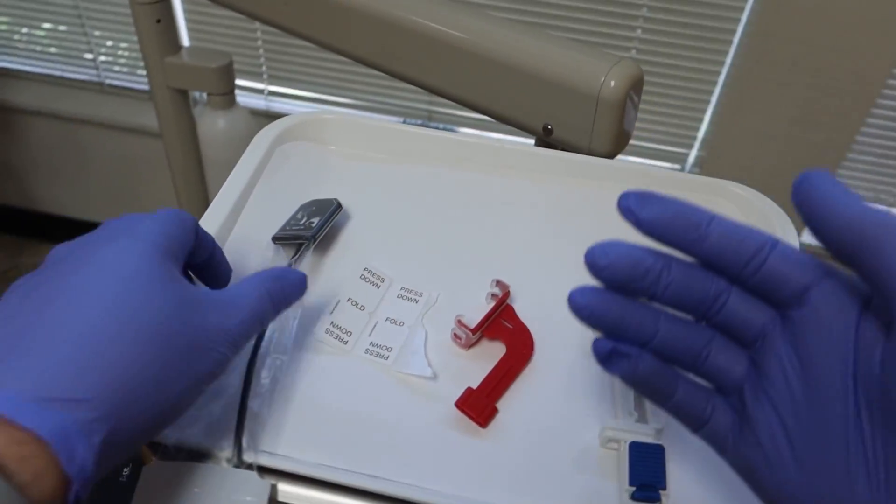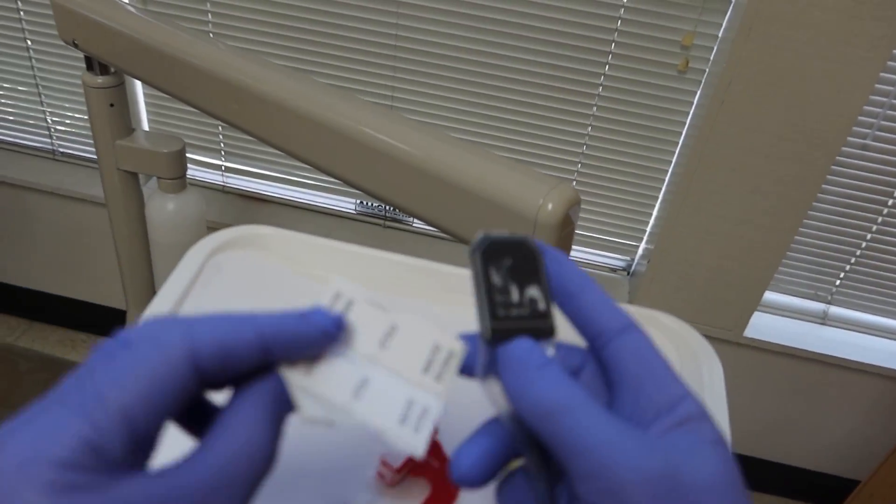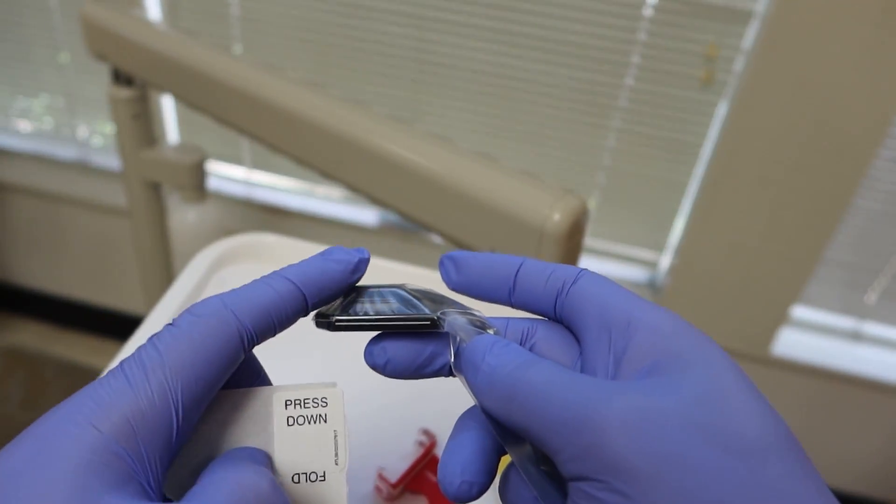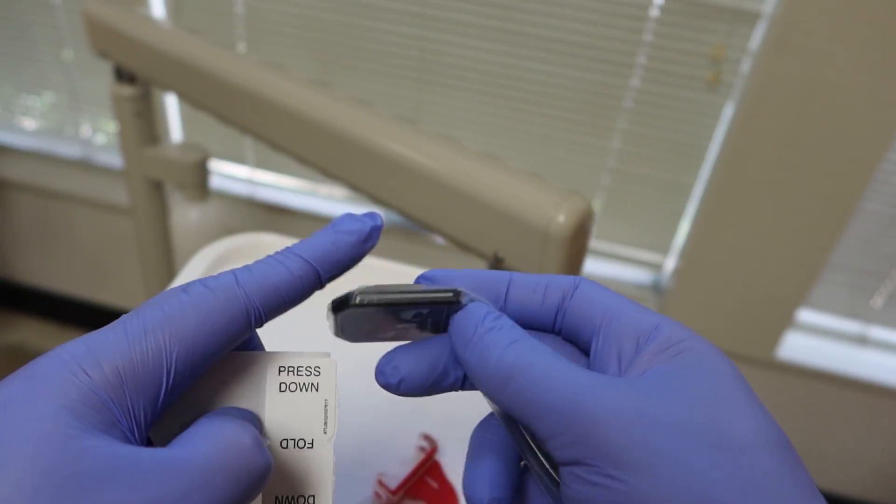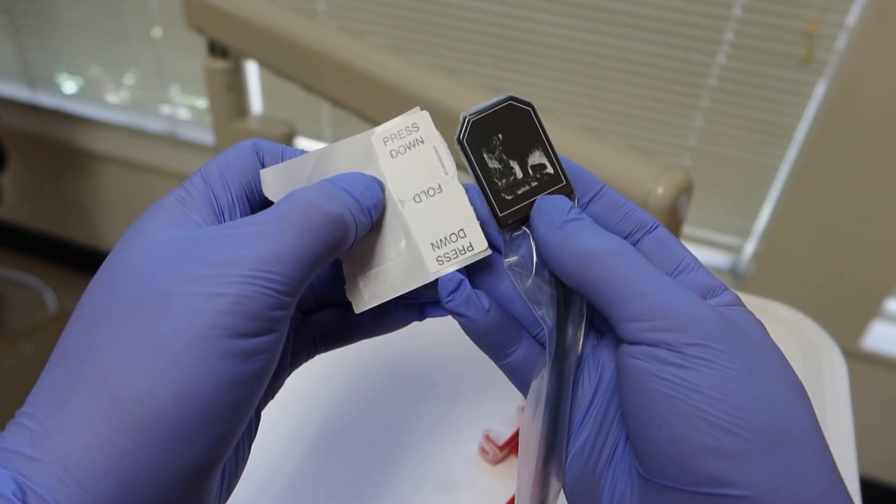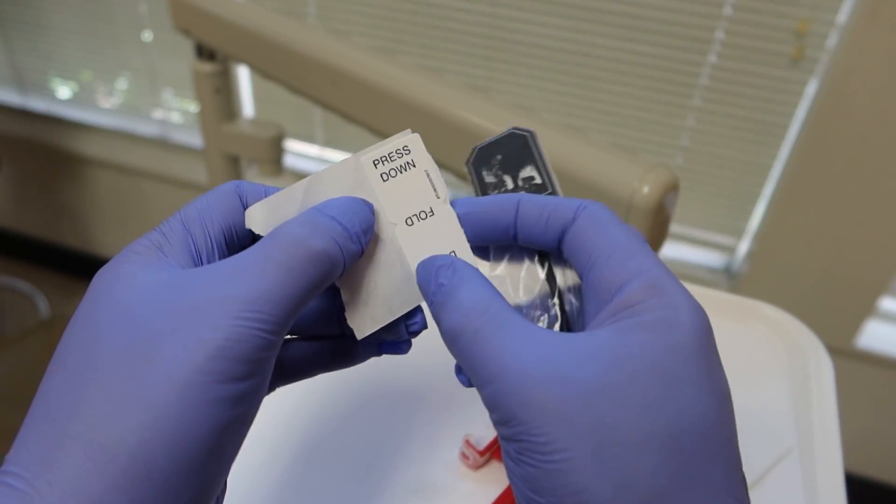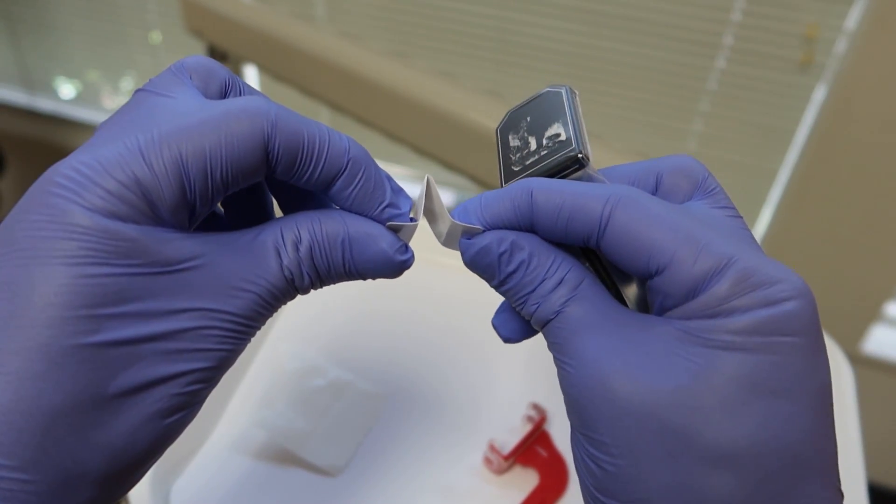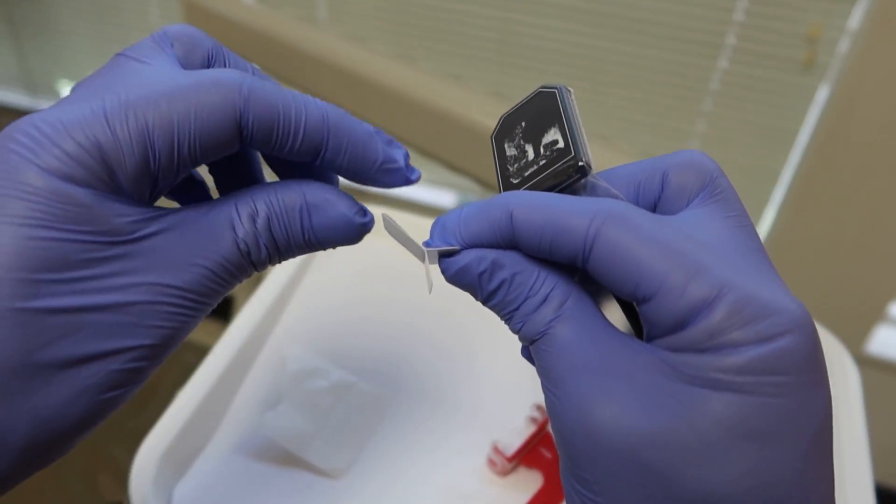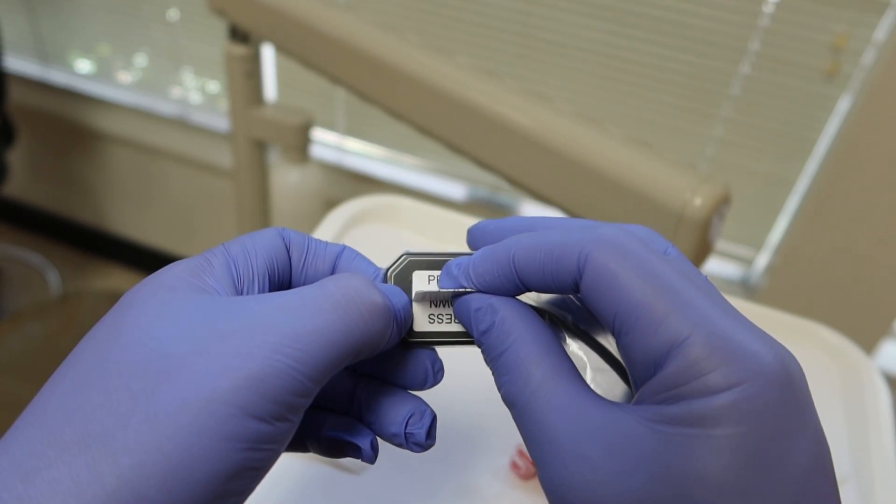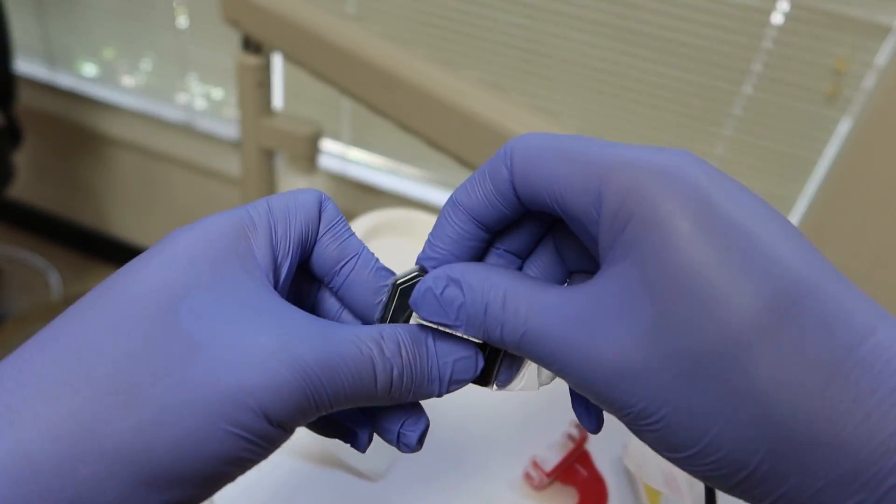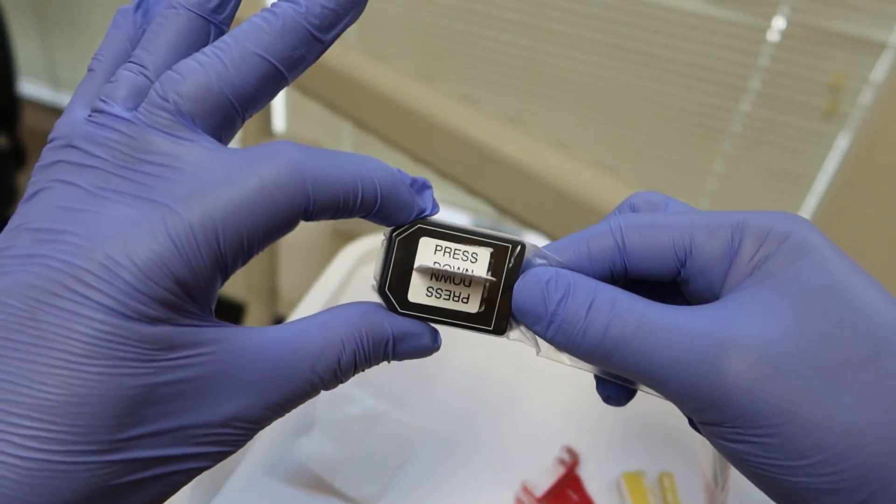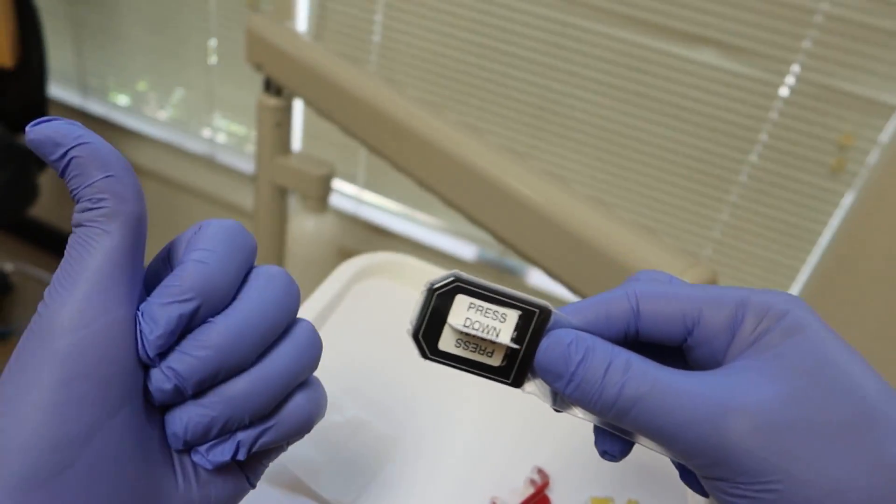And let's go ahead and look at our instruments. Like I mentioned before, you can go and use one of these little sticky tabs. The flip side is gonna have the actual wire and all the hardware that's behind here. Never put it on this side. So with these little bite tabs that we have here, they're nice and a little sticky. And with that, if I just go and peel one of these off, and I fold it right in the middle, but leave those little T's off to the side. Because this is a bite wing, we want to make sure that it's stuck right there in the dead center, and that it's horizontal, make sure that you go give it a little bit of push to fix it to the piece. And now we can go and take this to our actual x-ray dude over here.